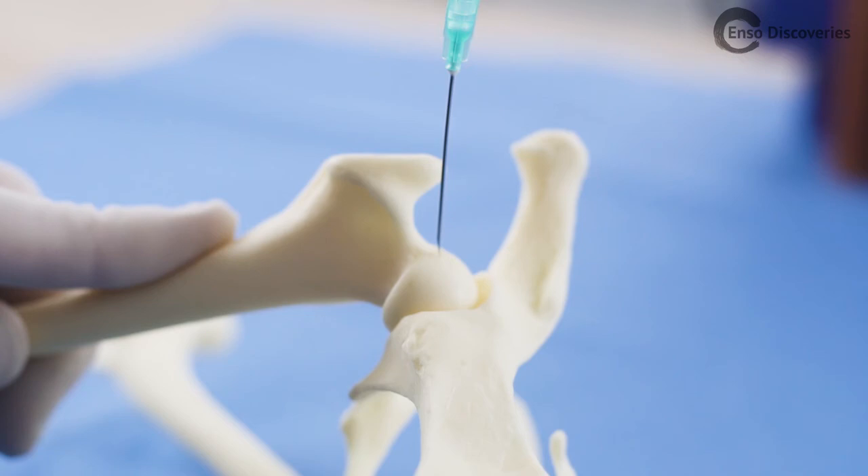Additionally, you are more likely to aspirate synovial fluid. However, the needle is very likely to scratch against articular, weight-bearing cartilage. A better place to inject the joint is up on the cartilage not covered by the acetabulum — this is articular cartilage, thus in the joint space, but it is non-weight-bearing, thus less likely to do any lasting harm. The downside is you do not have the feeling of popping into the joint, and you are rather unlikely to aspirate synovial fluid.